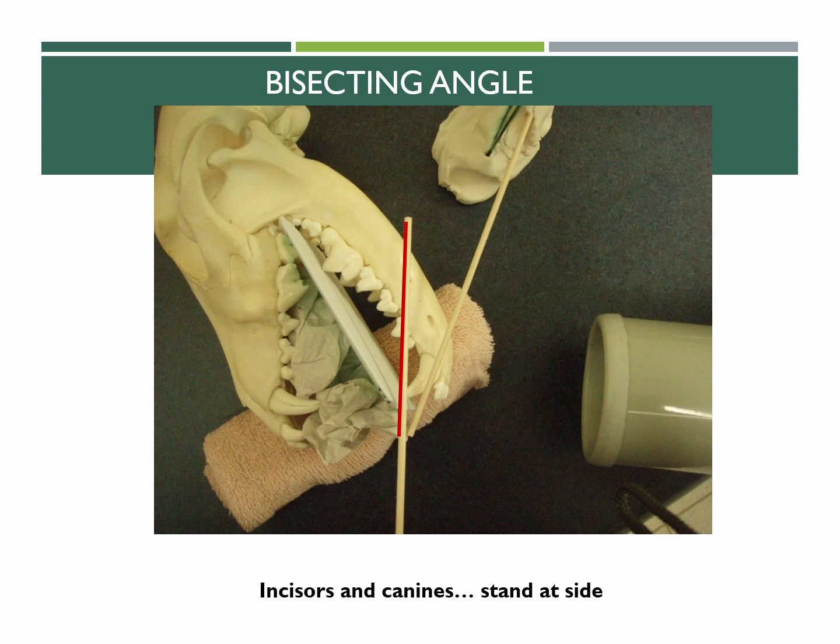Now, just a little chat here. Now that I'm seeing this laying on its side, we're going to teach you to do everything in lateral. A lot of stuff out there on the internet, it's handy, but they do a lot of stuff not in lateral, with the animals in sternal, and that's not really great because most animals, when we anesthetize them, we have them in lateral. So we're teaching you how to do that all in lateral, so you're not moving the animal around as much.